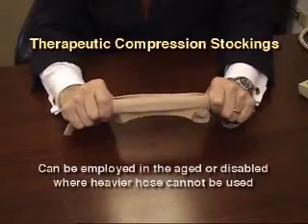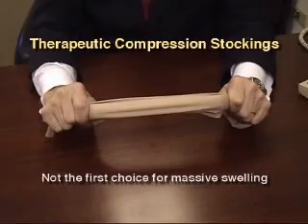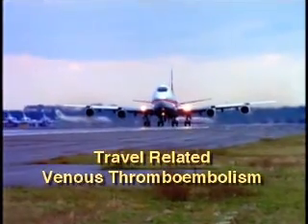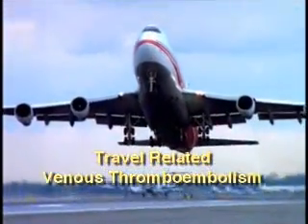The greater the pressure in a stocking, the more difficult it is to apply and remove, and the more expensive it is. It is not the intent of this video to suggest brands of stockings, but we strongly urge those who prescribe these products to get samples, to wear them, and compare them. The Class 1 stocking should not be the first choice for those with massive swelling. There is some evidence that these products are useful in those airline passengers without edema or severe venous disease in order to prevent some blood clots. They are also used by some therapists following spider vein injections.